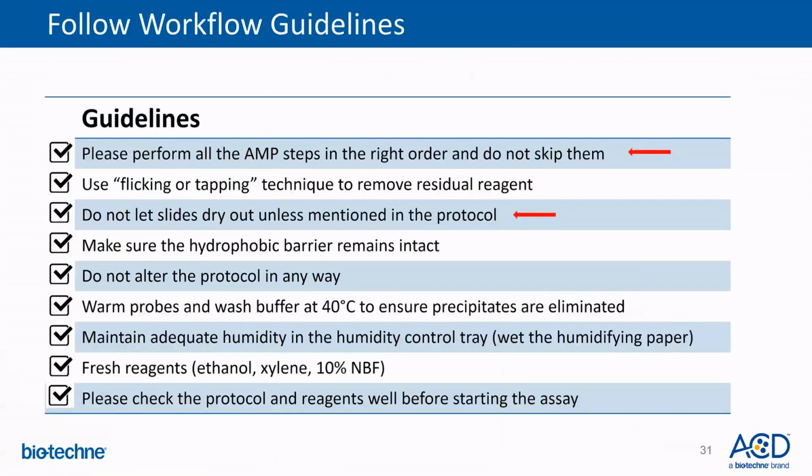We will now look at some of the workflow guidelines that should be followed. A couple of important guidelines from the list include: please perform all the AMP steps in the right order and do not skip them. Failure to do so will result in weak or no signal. Do not let the slides dry out unless specifically mentioned in the protocol.